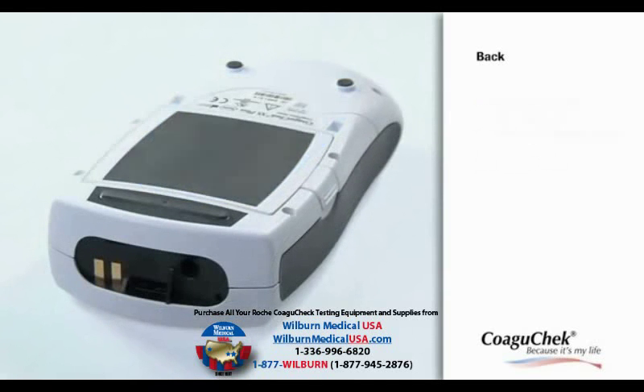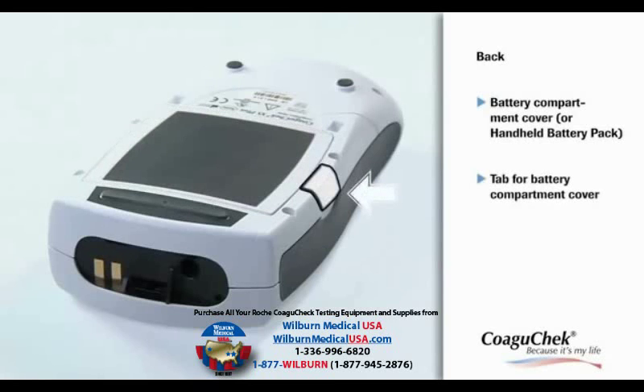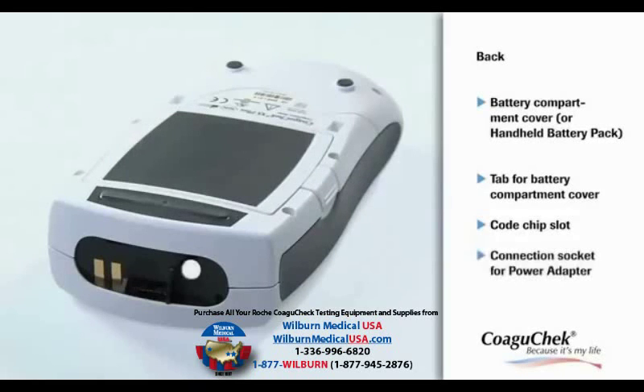At the back of the meter, you will find the battery compartment cover and a tab to lift the cover. The code chip slot is at the top of the meter — this is where the code chip has to be inserted. In the connection socket, you can plug in the power adapter.